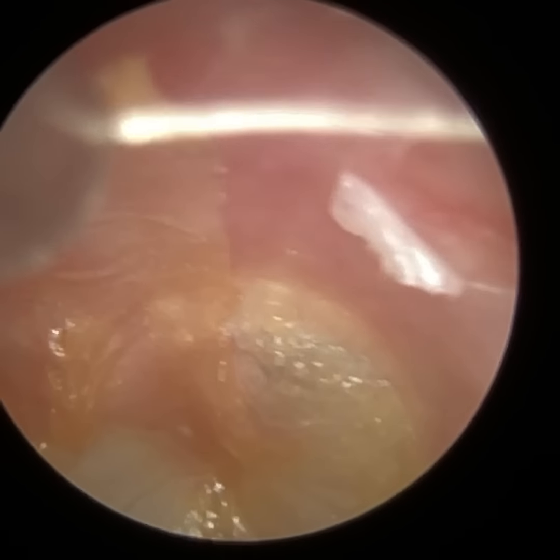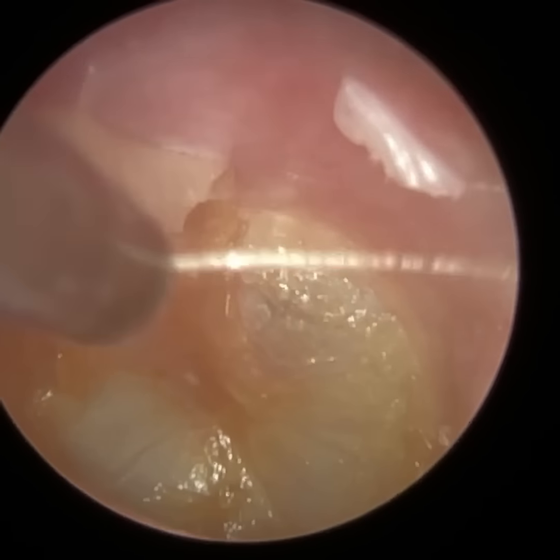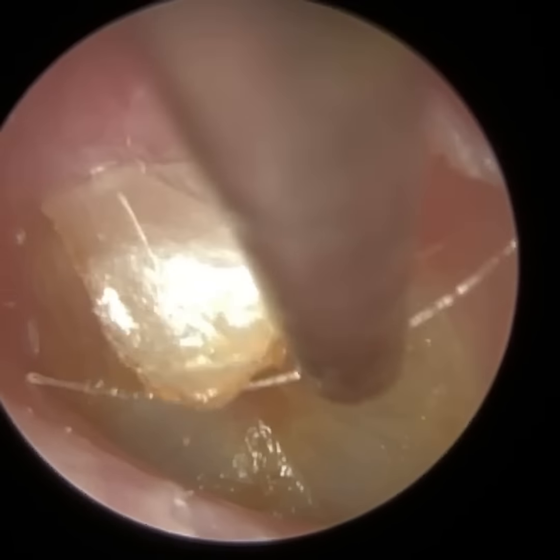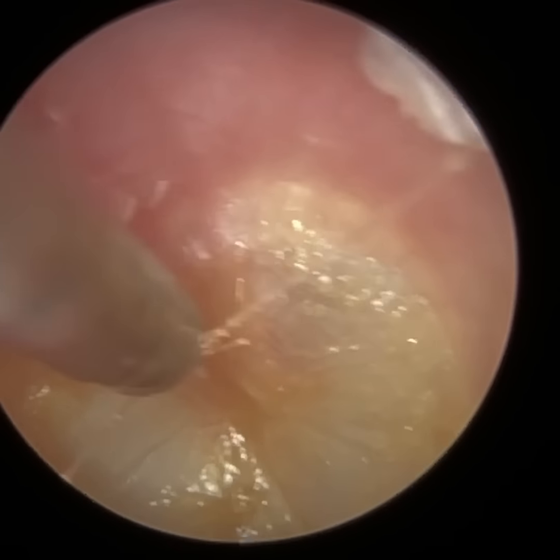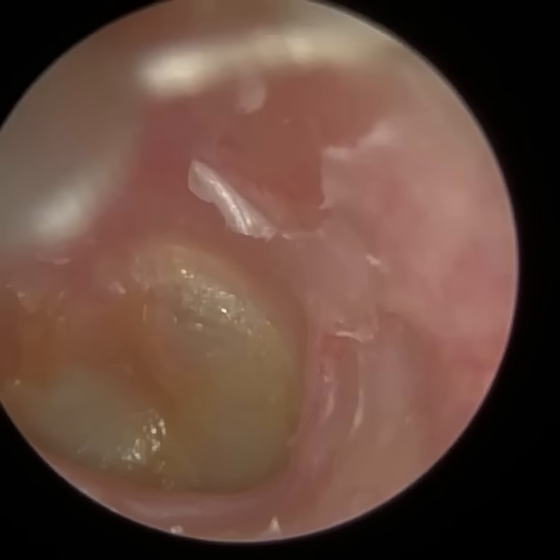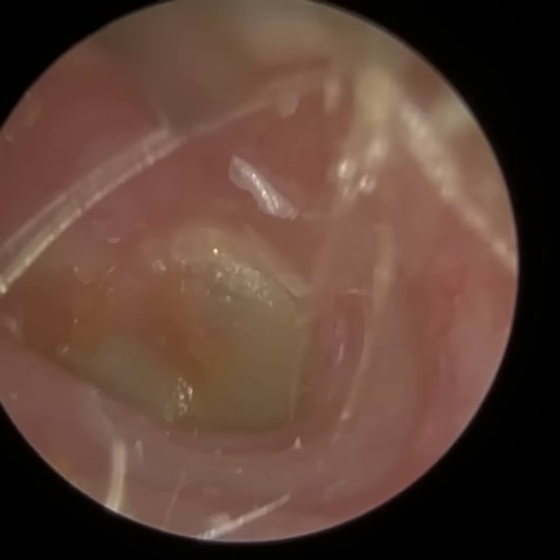Sometimes you can ask the patient. So in the case of the left ear, I would ask the patient to tilt their head so the right ear is going towards their right shoulder. And that elevates their left ear, so I can view the superior aspect a bit better. But the patient wasn't able to do that because they had a bit of a stiff neck. So I just crouched down, looked upwards. So you can see the difference here already.